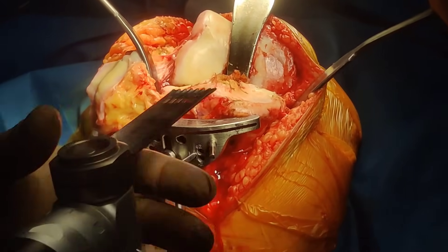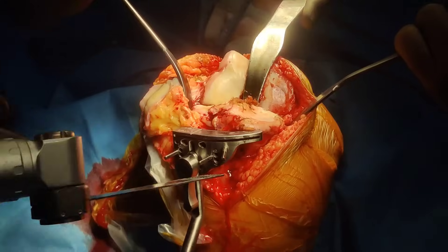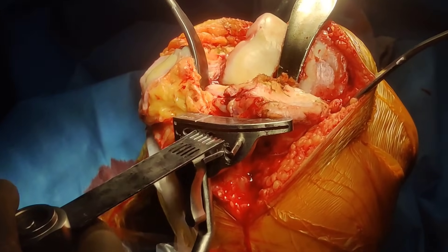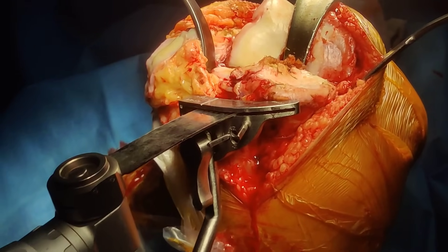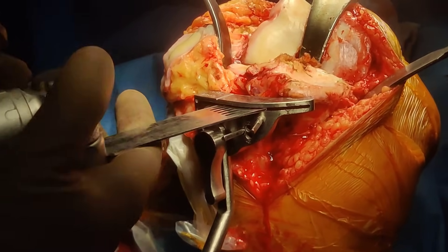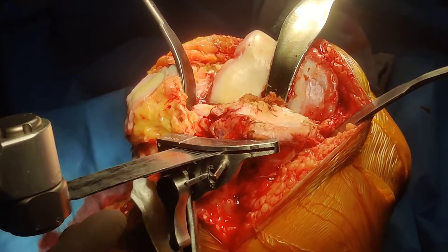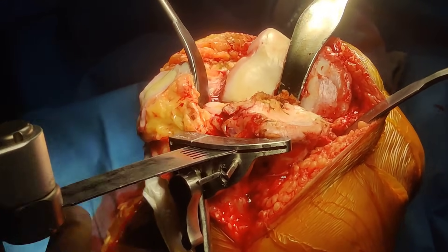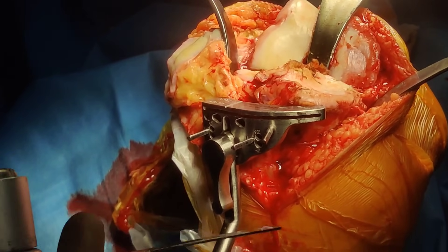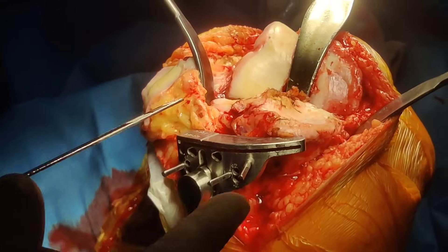Now I am ready to take my cut. You can do this forward or in the reverse way. Most cutting in knee replacement is done in reverse — because if you bend the saw forward it will dig into the bone and you will take more bone. If it bends the other way you take less bone. Ideally your saw should be straight and at full power. Always full strength — that is the first rule of cutting bone.